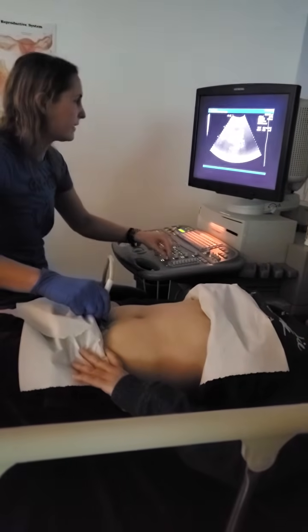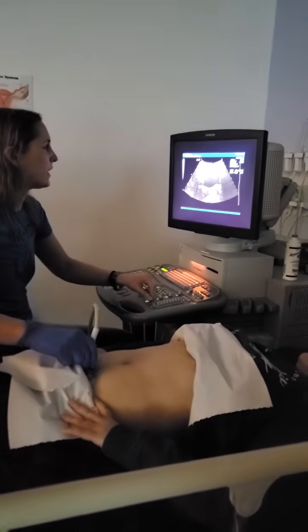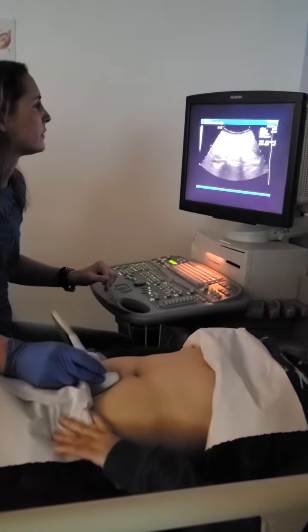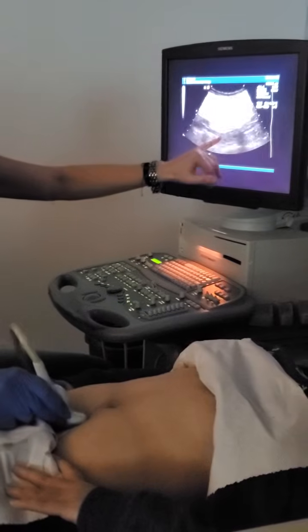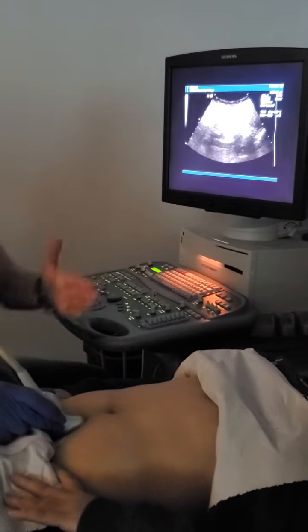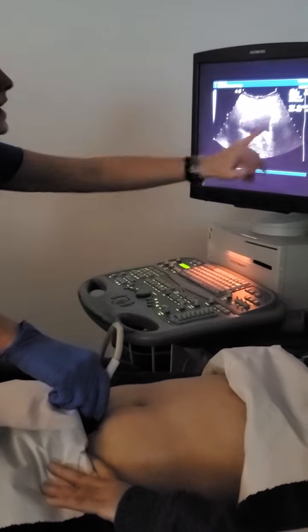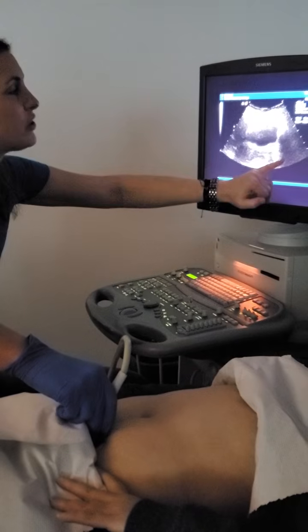Oh, look at that. Okay. So let me tune you down a little bit. So we are used to, where's aorta distal? Somewhere in here. So we're used to seeing kind of iliacs, aorta distal coming down. So notice I'm going to rock my transducer inferiorly. I'm not really sliding, I'm just rocking. And then this is her pubic symphysis.